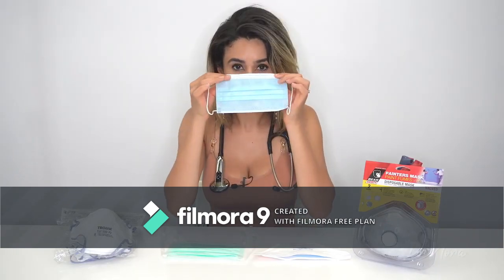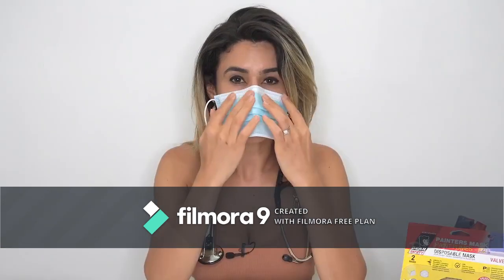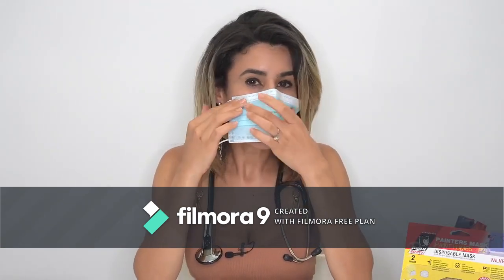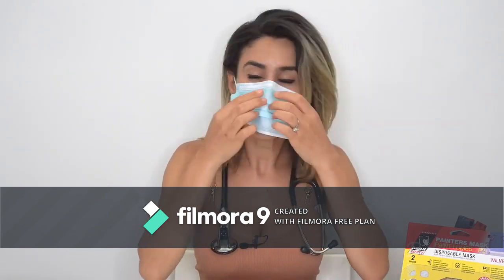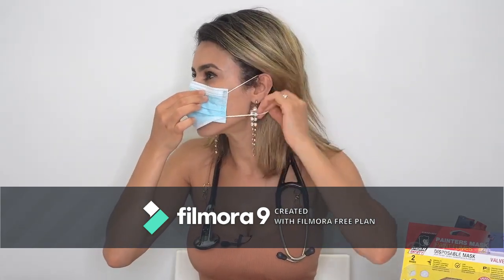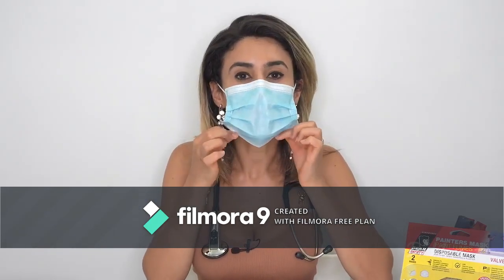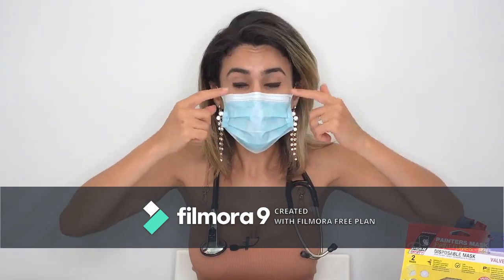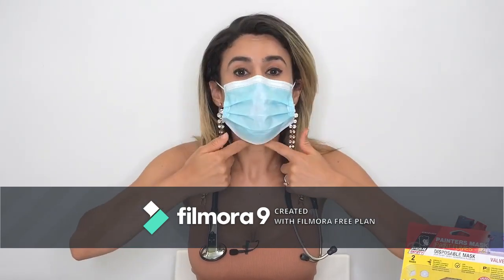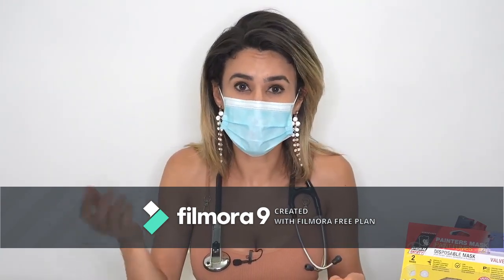The surgical mask is placed around the nose and you press in with the metal so it's closely pressed by your cheekbones, then you place the elastic bands over the ears on both sides, and finally bring down this area to cover the chin. But as you can see there is a lot of gap seepage of air from here and also down here, and hence that is why it's not suitable for protection against viruses.